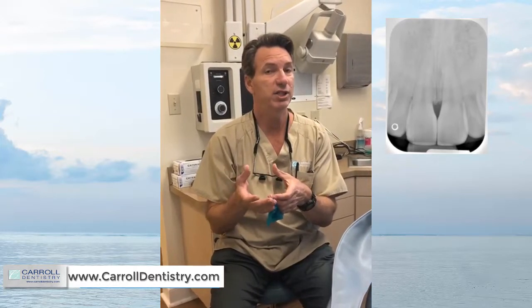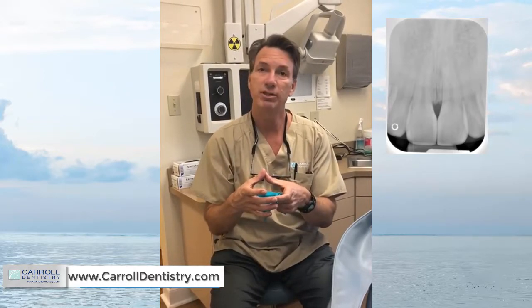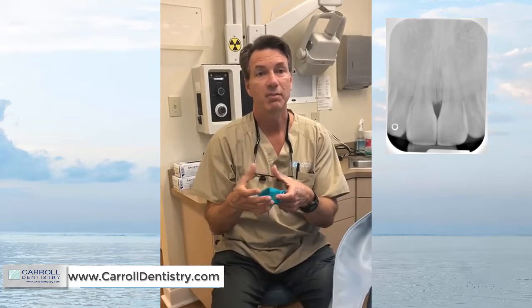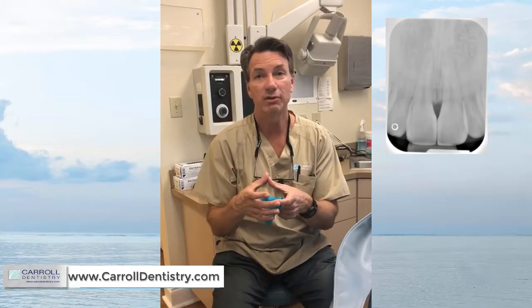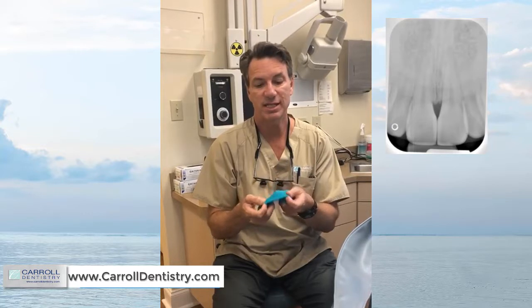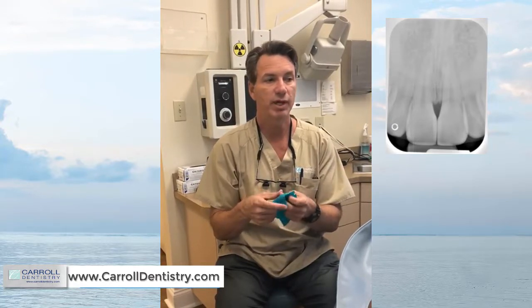This gives you cleaner margins and better adaptation at the gingiva with less finishing work to do. The infinity margin that BioClear provides is probably the best margin in restorative dentistry, with maybe the exception of the best gold crown you've ever done. Rubber dam really assists that kind of margin development.